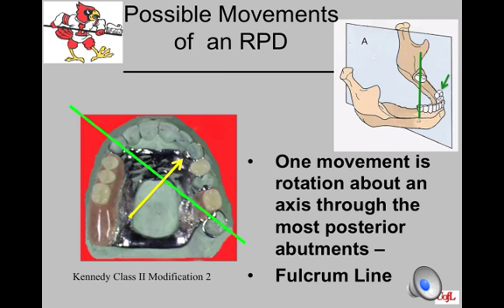When the patient eats sticky foods, the partial denture extension base wants to rotate around the fulcrum line in an occlusal direction. When the patient bites down on a bolus of food, the extension base again rotates around the fulcrum line, and the partial wants to lift off of that tooth anterior to the edentulous area on the tooth-supported side. So we will clasp that tooth also. There are 3 abutment teeth clasped for the Kennedy Class II RPD design.